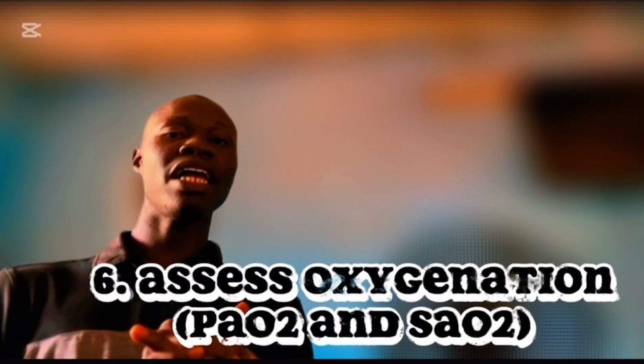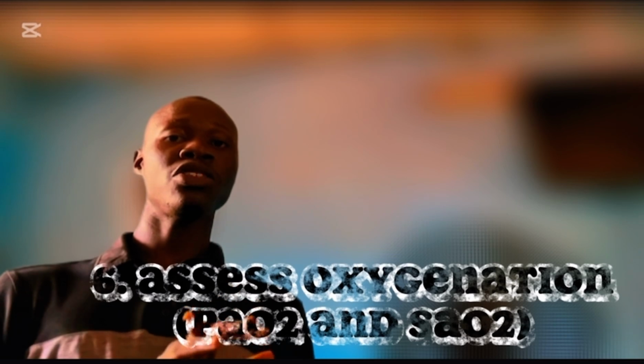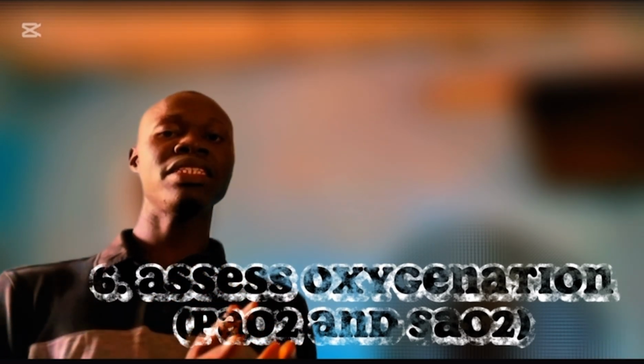The sixth step you want to look into is assessing oxygenation, which is the partial pressure of oxygen and the saturation level of oxygen. Remember we said that ABGs look at the pH, the lung function, the kidney function, and also the oxygenation level. So that is why we are checking for partial pressure of oxygen and saturation of oxygen. So with this, we are going to dive into real life patient scenarios. This is what will help us understand this phenomenon better.